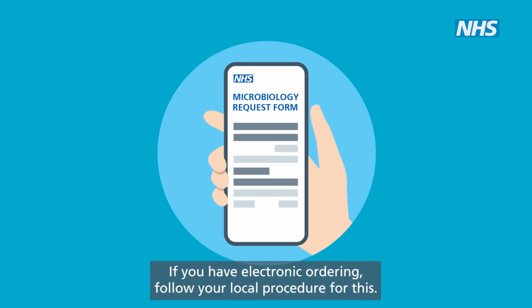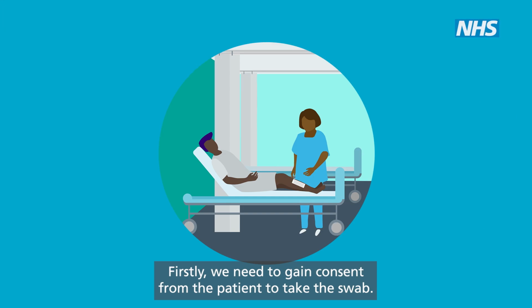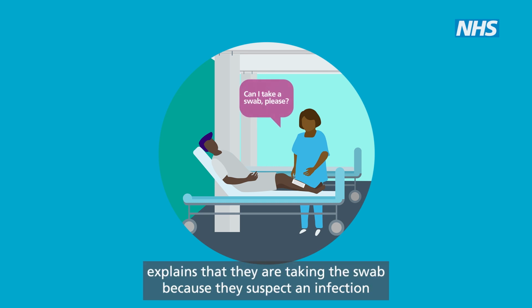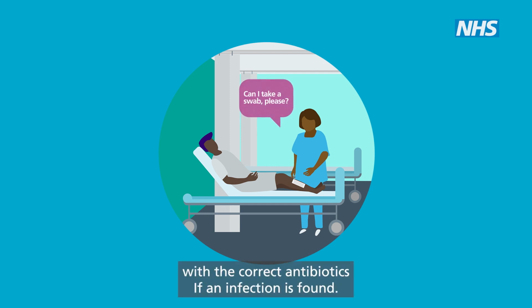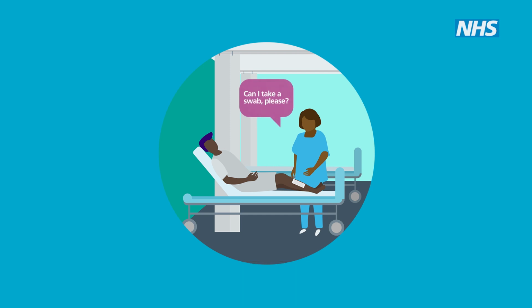If you have electronic ordering, follow your local procedure for this. Firstly, we need to gain consent from the patient to take the swab. It's important that the healthcare worker explains that they are taking the swab because they suspect an infection and they need to find out which pathogens are causing the infection so the patient can be treated with the correct antibiotics if an infection is found. If possible, it is best practice to take a swab before antibiotics are started.